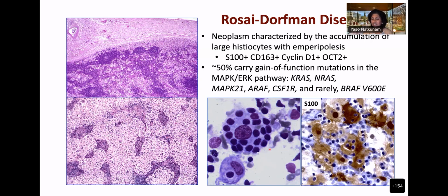And in hemophagocytosis, the difference is that they engulf lymphocytes. Actually, the type of cells can be the same, but they are usually more destroyed, because in hemophagocytosis it's really a phagocytic function, and you see remnants of cells much more commonly. In here, the intactness is more common. You can sometimes see remnants, but usually you see intact cells. In both, you see nucleated cells, and that's really the definition. Seeing any remnant doesn't count, because the histiocytes' function is phagocytosis, so they eat up a lot of debris. You really need to see nucleated cells within the cytoplasm.